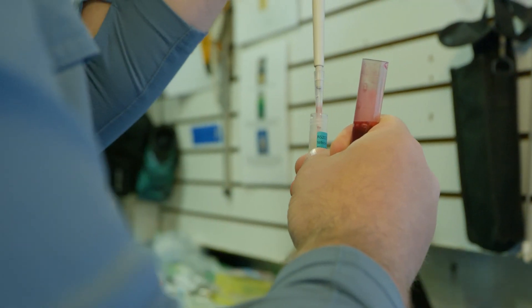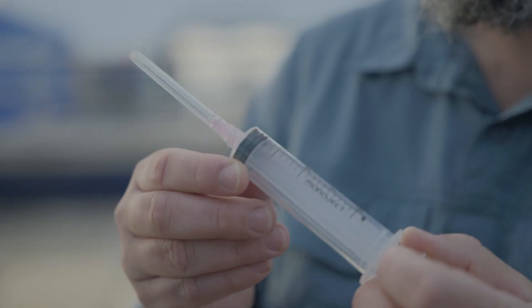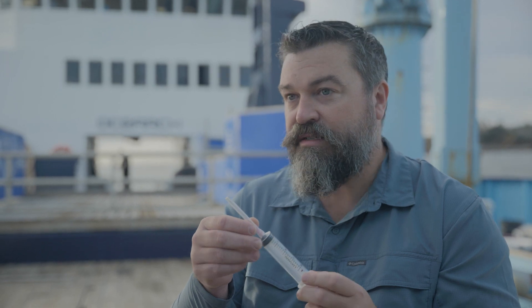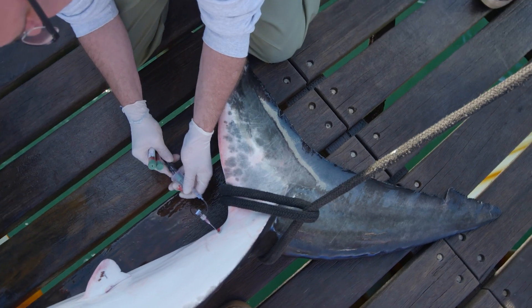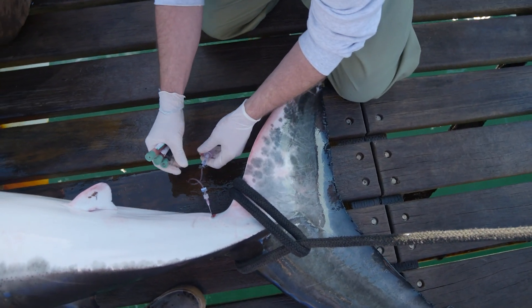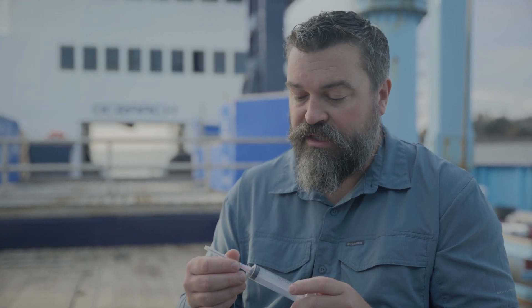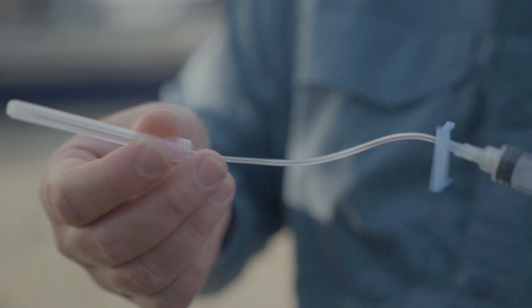It's over a third of the projects that are involved with this. The way we do that is with a needle and syringe — we use the peduncle right by the tail, and that's the easiest access to a vein that runs right along under the spines called the ventral coxygeal vein. Once we get the needle in through the puncture, we can draw back blood. Because we're collecting such a large volume — around 24 mils or so — we need to switch out syringes, which can be cumbersome. A lot of people like to use an extension onto this so it gives you a little bit of leeway so you don't accidentally dislodge the needle from the vein.